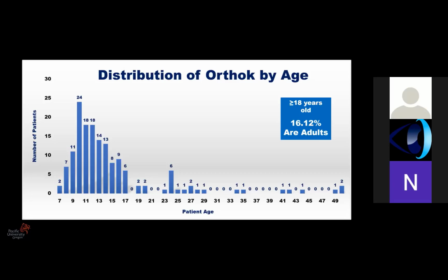Patients who wanted to be free from glasses and contacts during the day, but I was concerned that refractive surgery may actually exacerbate their dry eye symptoms and lead them to be much more uncomfortable, maybe not this year, maybe not next year, but 10, 15 years down the road as that dry eye disease progresses. By offering Ortho-K to those patients, they achieve their goals, and we can keep those corneal nerves intact, keep that feedback pathway driving tear production intact, and we don't have to disrupt that. So for me personally, that's really the population I was targeting when we were talking about adults in Ortho-K. Well, thanks, Steve.